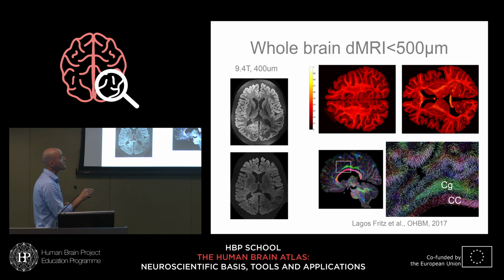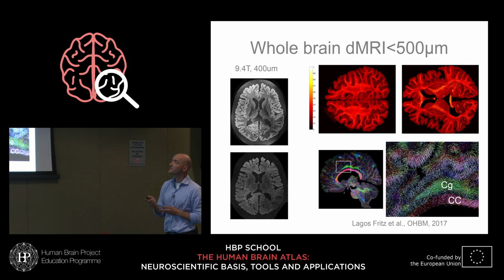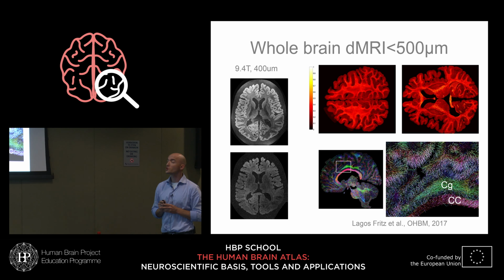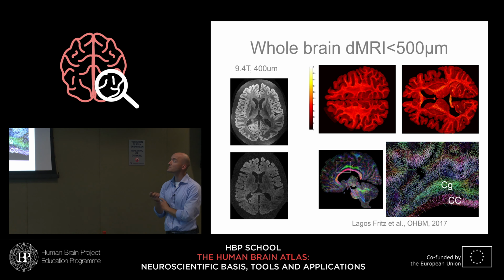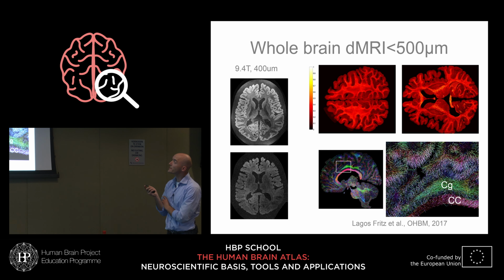And here you see some analysis results, and you can see that simple analyses like DTI, or in this particular case ball and stick, will show you, and this here is a stick fraction map, so how much of the diffusion in a certain voxel can be explained by anisotropic diffusion, different in some directions than others, rather than isotropic diffusion, the same in all directions. It shows you beautiful, almost anatomical looking white-gray matter contrast, and it already starts to show you higher density fibers, such as in the corpus callosum, the splenium in this case, but also the genu, and the corticospinal tract versus other places in white matter.